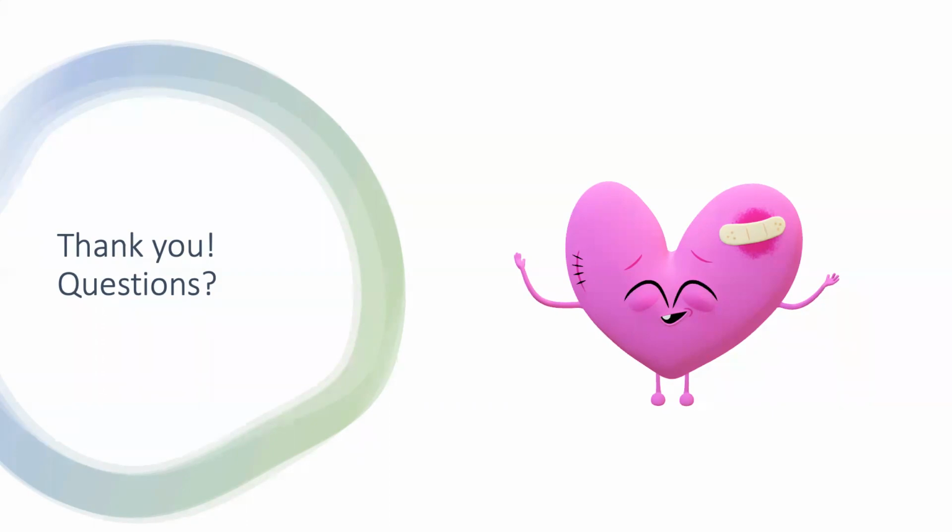I have a quick question. It might be more geared towards the echo team rather than Samir. If there's a concern for an aortic dissection in a hemodynamically unstable patient, and it's not 100% confirmed on transthoracic echo, but they're too unstable to go to CT, in terms of logistics of getting a TEE, I know usually it's done intraoperatively, but if the diagnosis is still not 100% confirmed, I'm just curious what the next step would be. Would it just be to do a TEE in the emergency department, or what would the suggestion be?